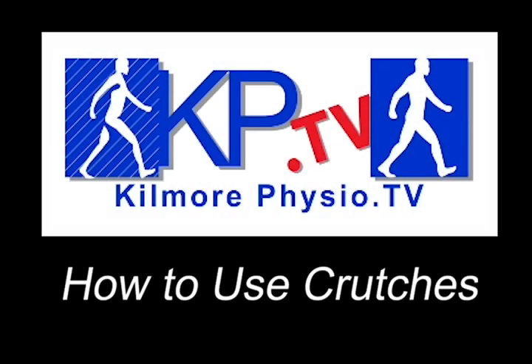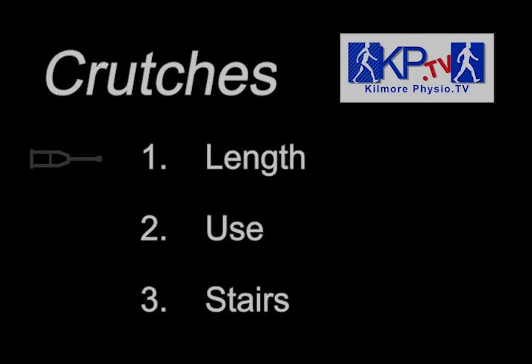In this video from Kilmore Physio TV, we will show you how to make sure that your crutches are the right length, how to use them, and how to walk safely up and down stairs.